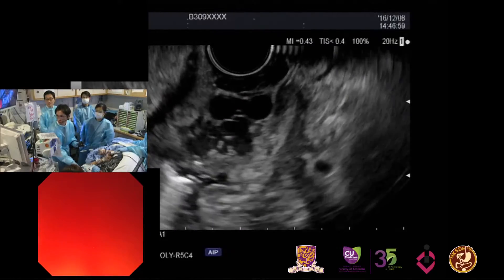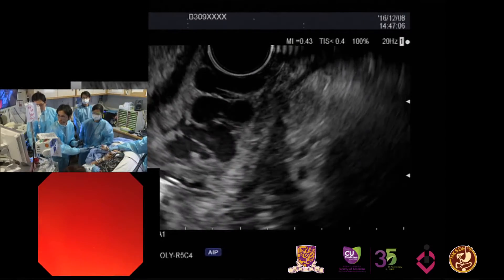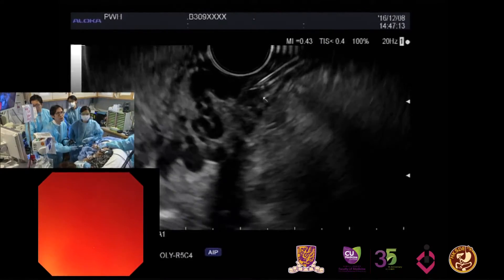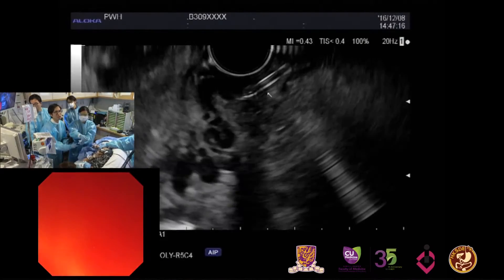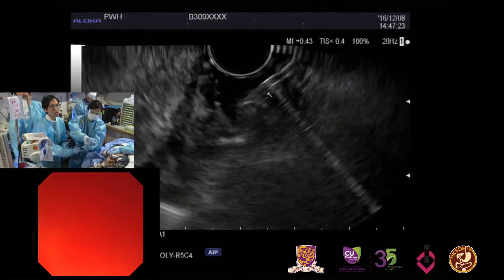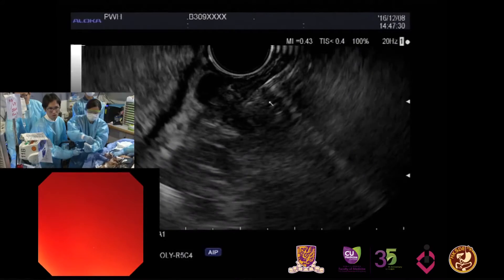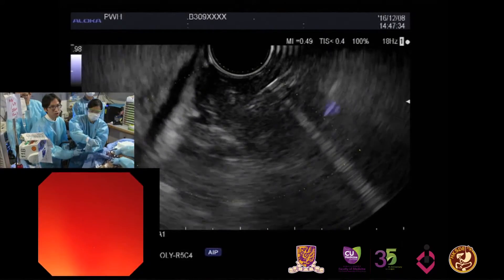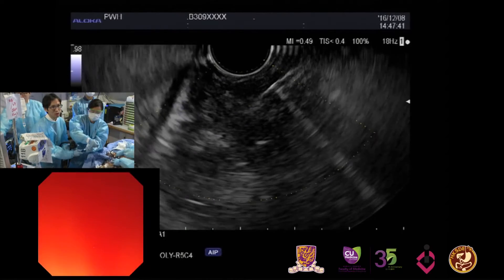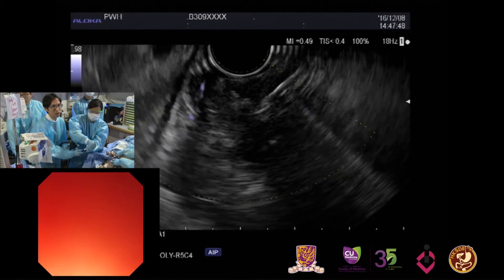We have the target in view. Can you hold the scope? We are ready to go in. My needle is coming in — we're in. We can start injecting some glue here. We're changing to lipiodol, pushing out. Let's check the Doppler. How much histoacryl did you use? The mix is 0.5 histoacryl plus 0.7 lipiodol. It looks like we have complete thrombosis of the GV here.